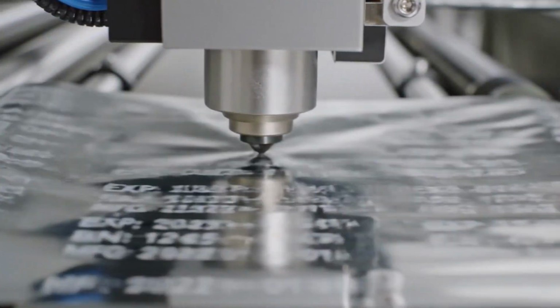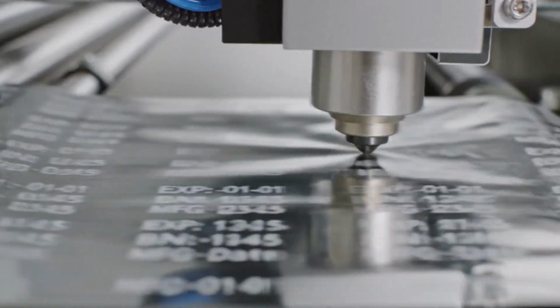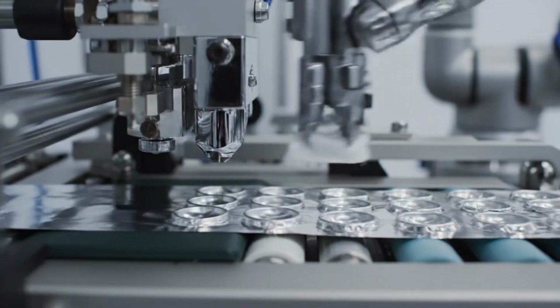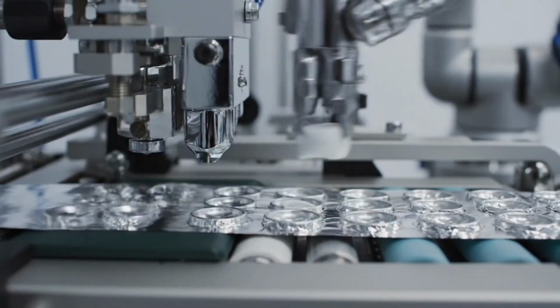Traceability is a legal requirement. We ensure every condom can be tracked back to the exact hour it was made. Precision timing ensures the condom lands perfectly in the center of its protective shell.